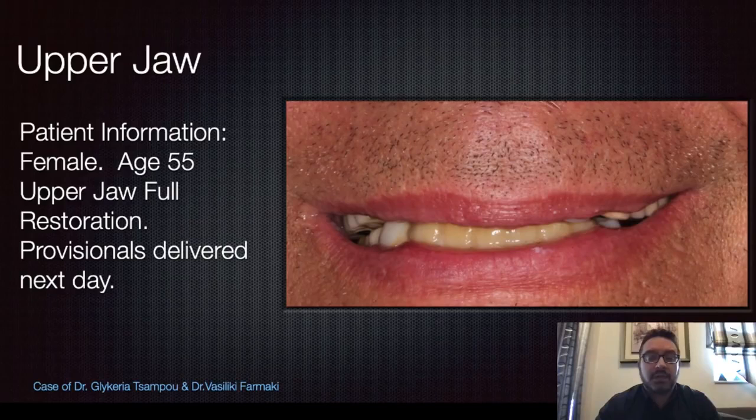So the dentists, after our suggestion, decided to, okay, let's place the implants with a surgical guide from the R2Gate. Let's decide the abutments that we are going to use, and I will take a pickup impression and send it to the lab. But the lab had already pre-designed the provisional in the ExoCAD, and then he adjusted it so as to fit our outcome. Let's see the case.